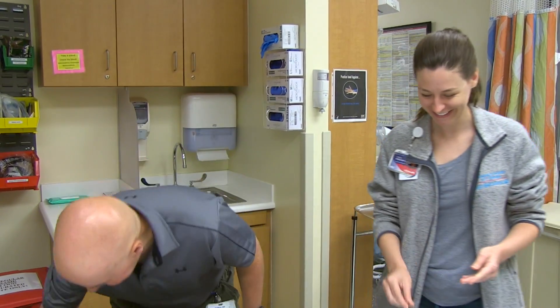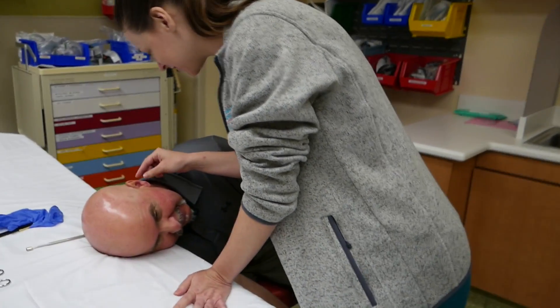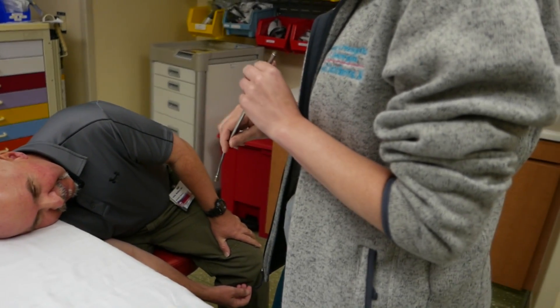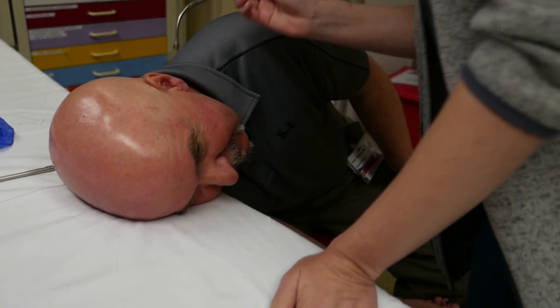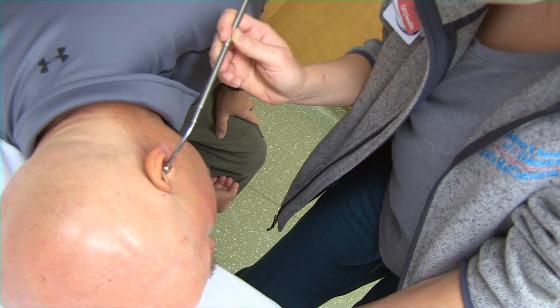All right, let's go. It feels like it's down there. Now we're going to go for it. Snap. Pop. I heard it. Very easy. Very easy.